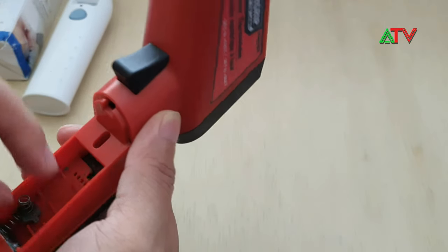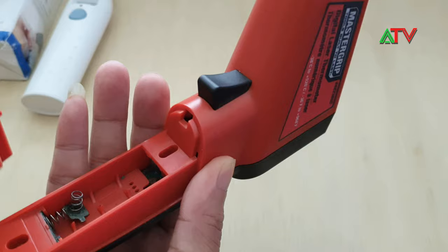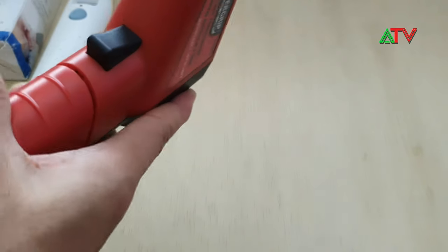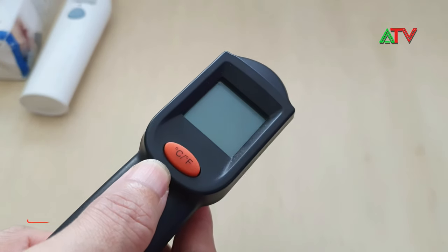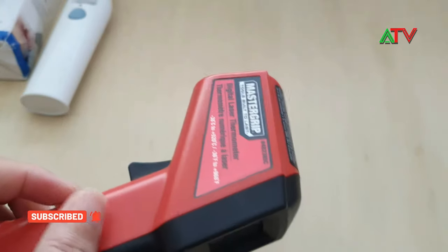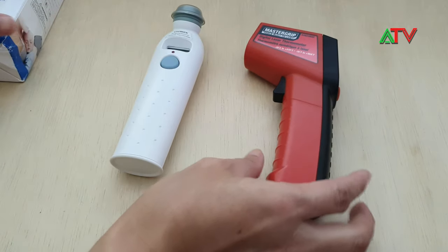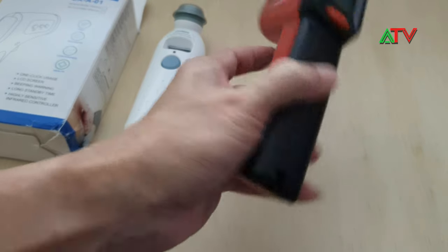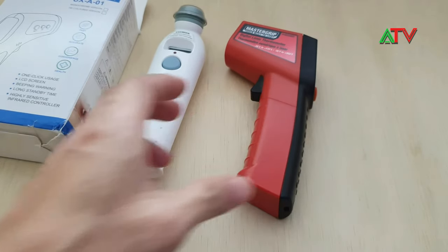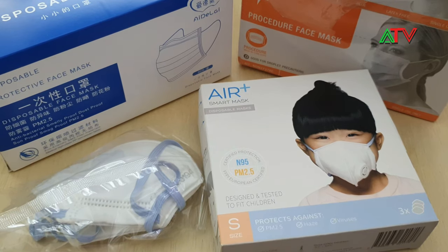The problem with this one is it also died because I left the batteries inside too long. The alkaline triple-A batteries leaked out and destroyed the PCB — that's the problem with alkaline batteries. It also has centigrade/Fahrenheit conversion and is very fast. So in summary: the first is a body thermometer, the second is also a body thermometer for the forehead only, and the third is for industrial use like buildings or rooftops.